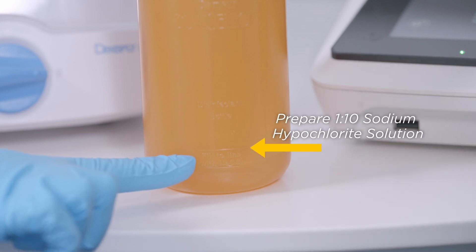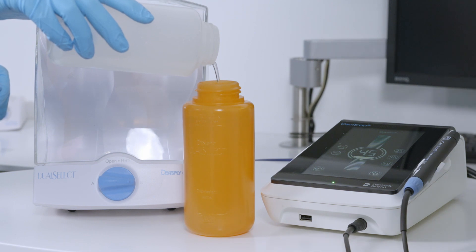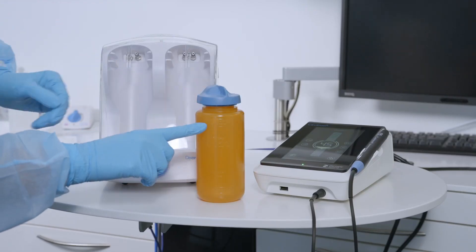Prepare a 1 to 10 sodium hypochlorite solution by adding 5.25% sodium hypochlorite to the designated line on the orange disinfectant bottle. Fill the remainder of the disinfectant bottle with tap water.